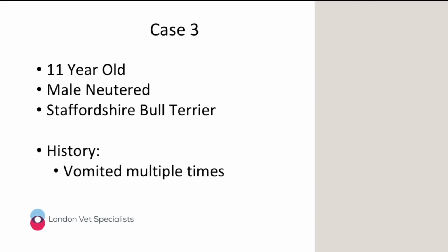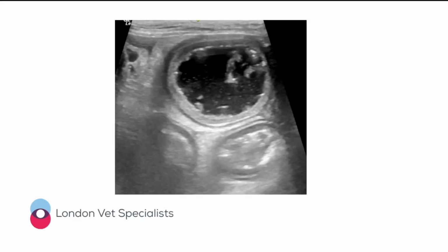So our last case is an 11-year-old male neutered Staffordshire Bull Terrier, and again, it's just vomited multiple times. So we'll take a little run through some of the ultrasound images we acquired for this patient. So this is our first one.